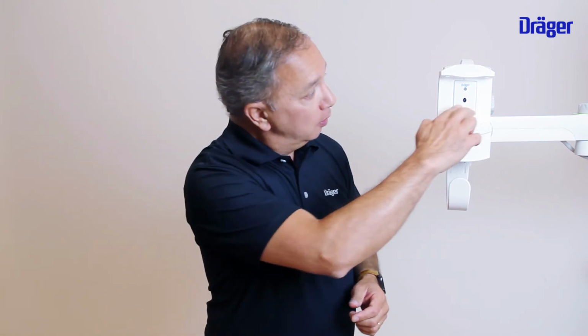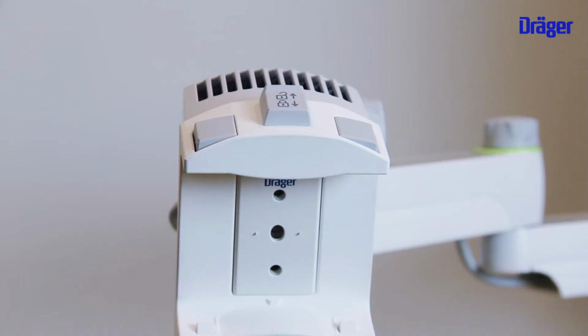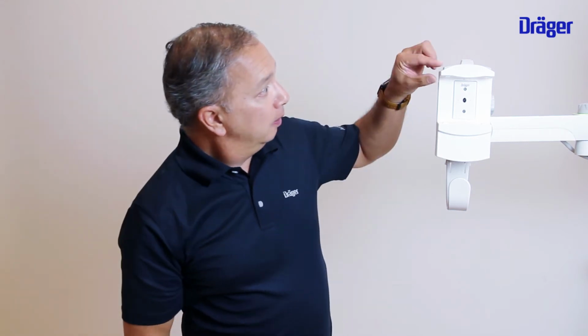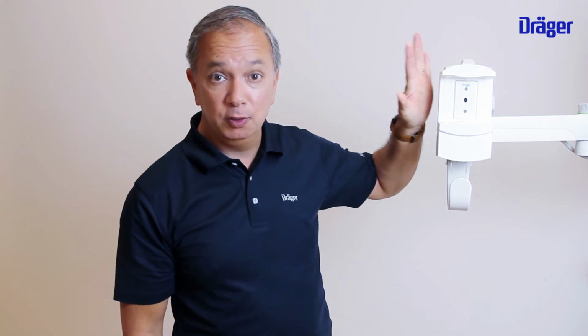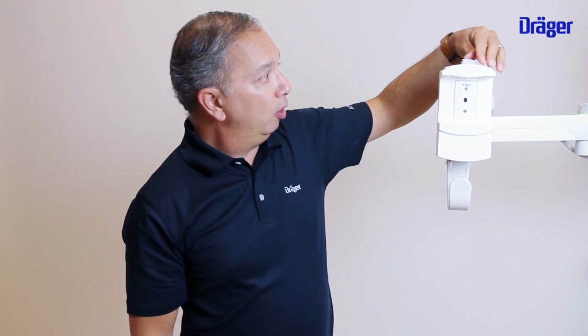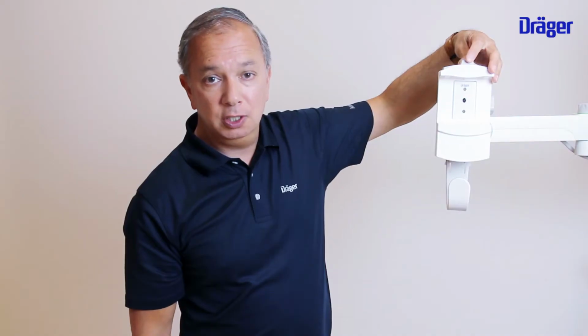The M500 docking station has different functionalities. So you see the pins over here. With those pins the M540 will be charged. Then you have the optical eyes over here. This is your communication between the network and your M540. Then you can disconnect the M540 from the docking station with this disconnect button, and then you have a lock over here with which you can lock the M540 in this docking station.